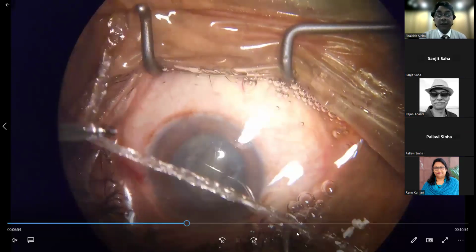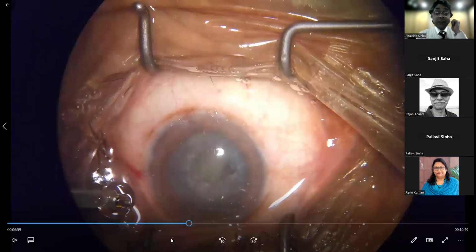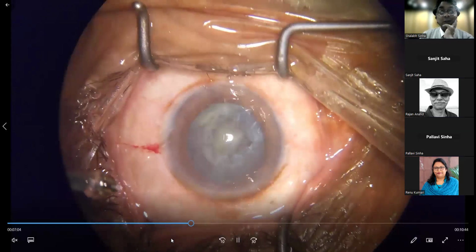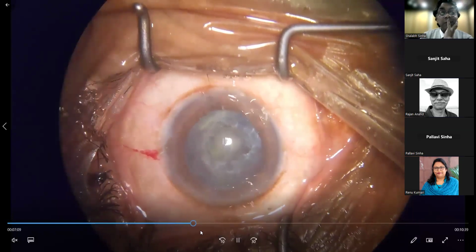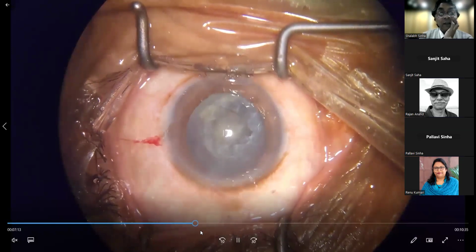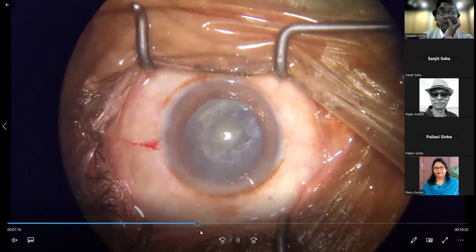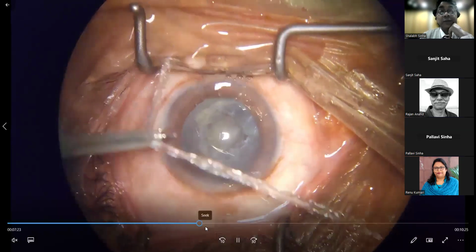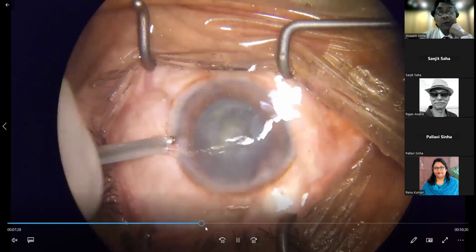At this stage, can't you do a rehydrodissection? Yes, I should have done that. Because you come out in the in-between time, it would have made life more simple. Yes. I didn't do a hydro, but thought that since the nucleus had started rotating, probably hydro was not required.